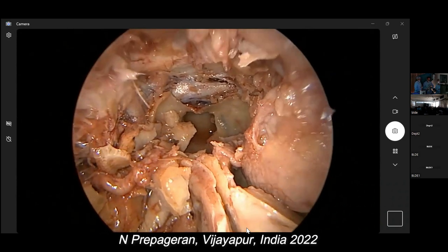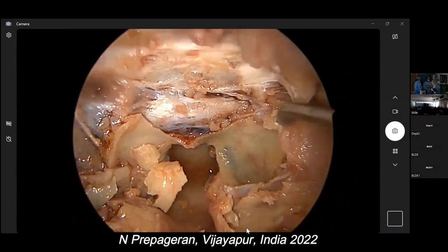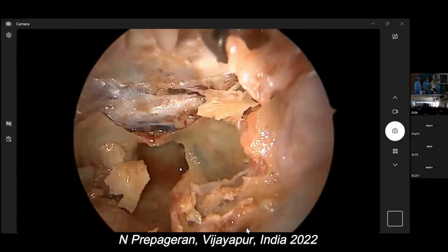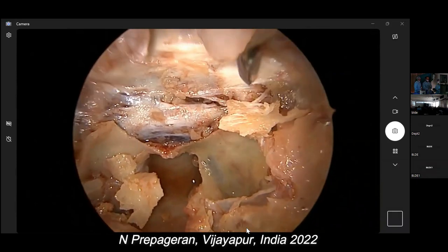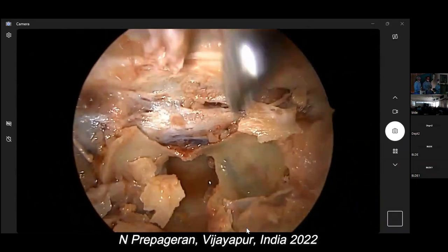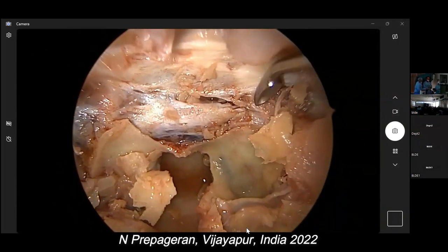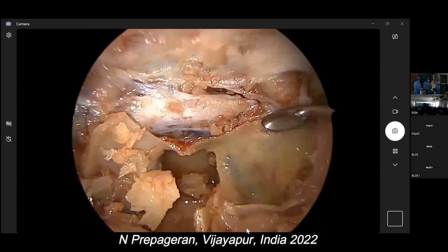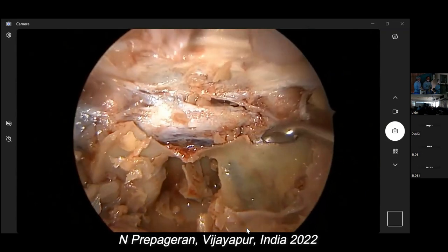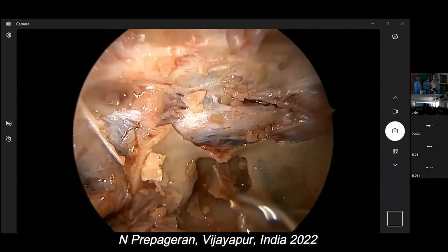So I'm going to go now. Okay, beautiful. Guys, can you see? Optic nerve exposed here. So I'm now going to expose the optic nerve on this side as well, and the carotid artery on this side as well. Can you see? So now we come to the paraclival carotid. You see where the carotid artery is? Here.